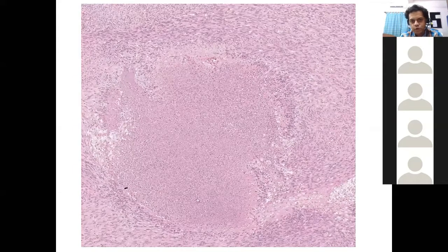Again, one big zone of necrosis. For the first years, this is how you will identify necrosis. You'll see a busy, cellular tumor, and all of a sudden you'll see a zone where there are no cells and where there look to be dots within these zones. Those are areas which have necrosed, and the peripheral zone of preserved cells gives an appearance of peripheral accentuation. So this is an area of necrosis. Whenever, in the setting of a soft tissue sarcoma, you get this kind of coagulative necrosis, you know that it is bad. So that's another important thing to be kept in mind.